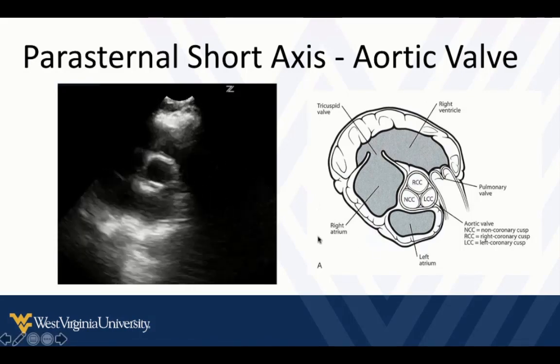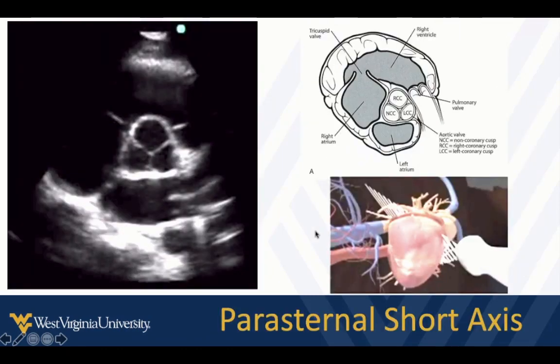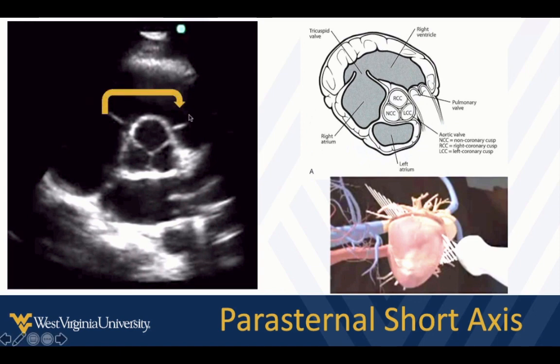Here's a labeled diagram of what we're seeing — a fantastic Mercedes-Benz sign, tricuspid, pulmonic, left atrium, and descending thoracic aorta. Ultrasound is a lot about knowing normal, having normal images and findings locked into your brain so that when something abnormal is present it stands out and you recognize it quickly. Remember that blood flow goes over top of the aortic valve in the parasternal short axis, which helps you remember tricuspid to pulmonic and the right ventricle position.